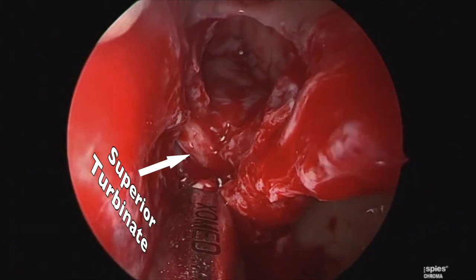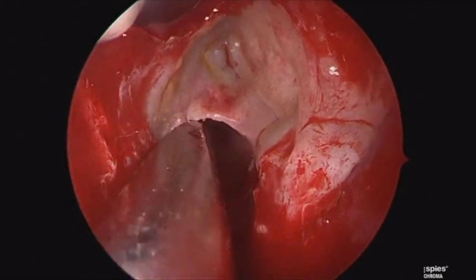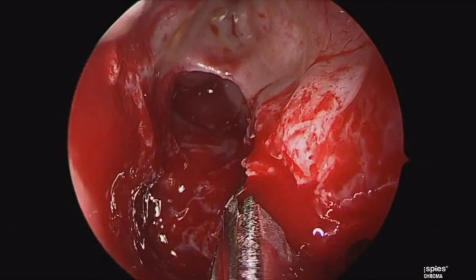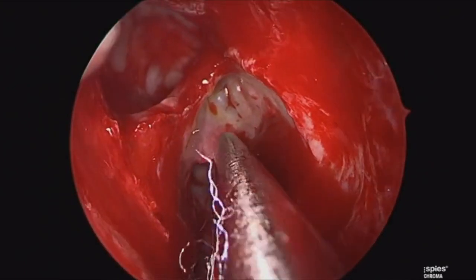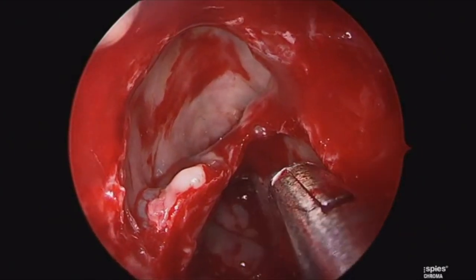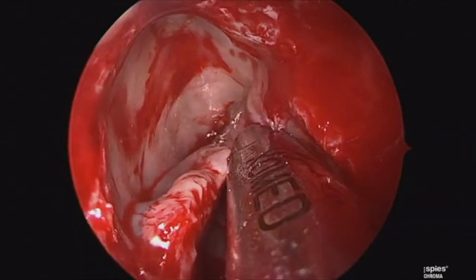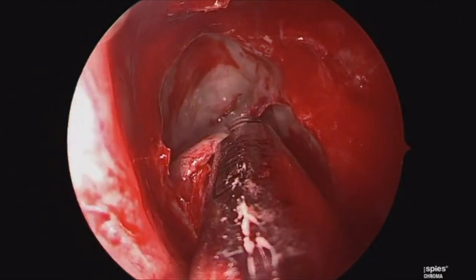The main goal in coming through the basal lamella is to identify the superior turbinate, which will guide your posterior ethmoid dissection and your sphenoid dissection to come. As you can see here, we're already looking at the posterior ethmoid roof. We're going to trim a little bit more of the lateral aspect there at that transition from the maxillary sinus to the ethmoid sinuses to truly expose the lamina papyracea in its transition. Here we are in the posterior ethmoids, taking down additional partitions with the upgoing tubular curette, transitioning this area towards the ethmoid skull base. Then with a 45-degree throughcut, taking down additional partitions in the posterior ethmoid cavity, identifying and skeletonizing the skull base. You can see the skull base behind us and the skull base in front of us, so here we are taking down that intervening partition to get nice exposure of that ethmoid skull base.